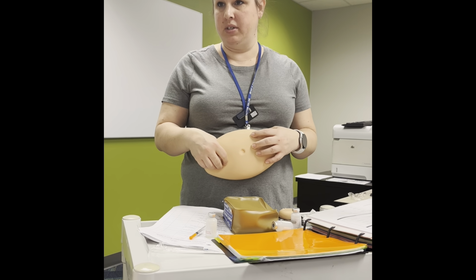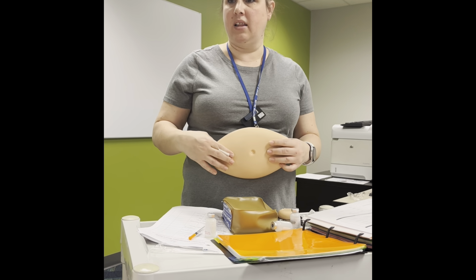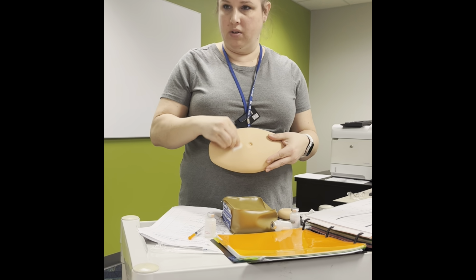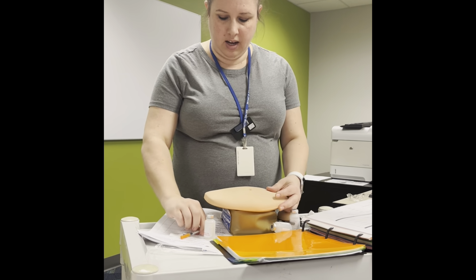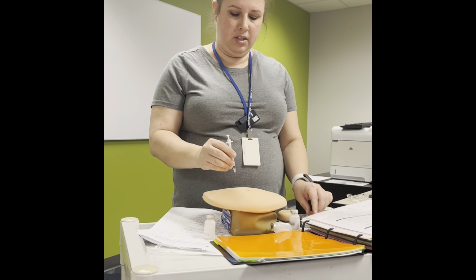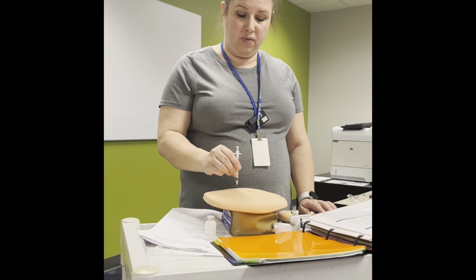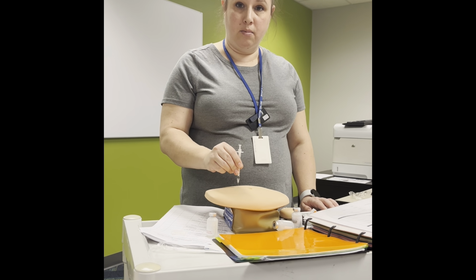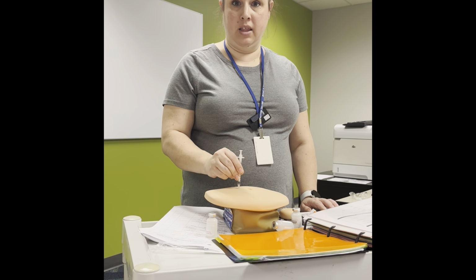This is supposed to represent a stomach. If you try to go out on the sides, there's not a lot of pad there, so it's okay if you go a little closer because there's just nothing there. So I'm gonna do my circle. Again, I'm gonna uncap, tell them I'm just gonna do a 90, so I'm just gonna go straight in. Be careful with these. This needle moves on these pads. These pads are a little stiff, so really kind of dart it in there.